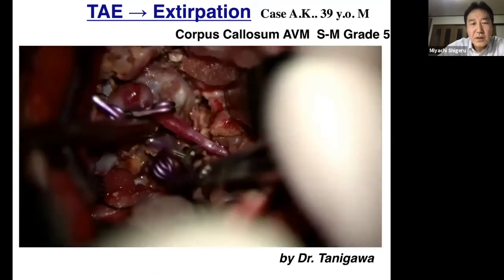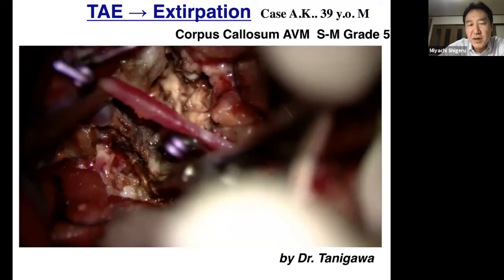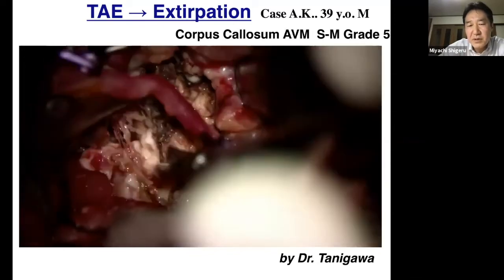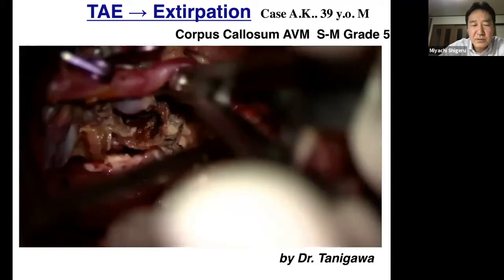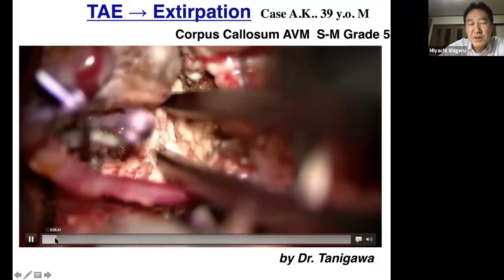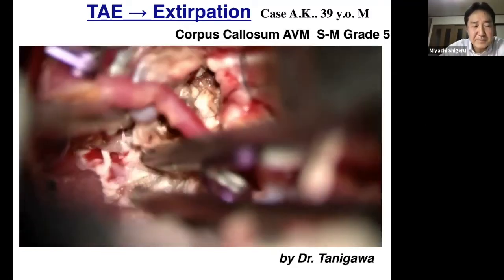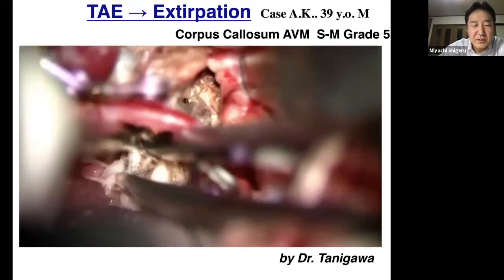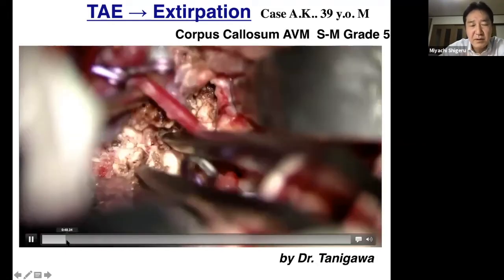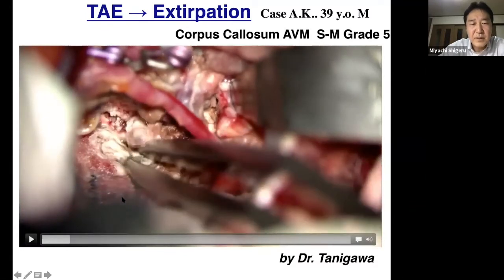You see there is no bleeding. This is very easy because so many feeders were embolized. It was a little bit hard, but he could cut the feeders very easily. Of course, he is also a good neurosurgeon, so it looks very easy. After the operation, he sent me the video and told me that the embolization was very helpful to facilitate the operation because there was no harmful intraoperative bleeding.